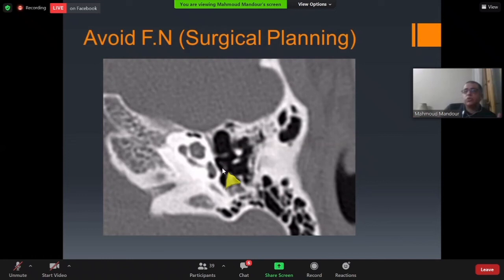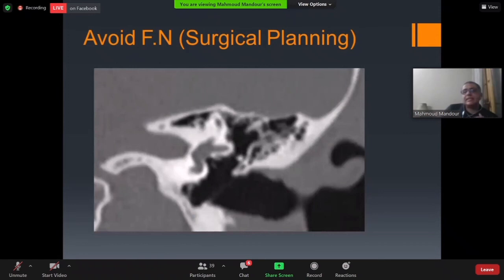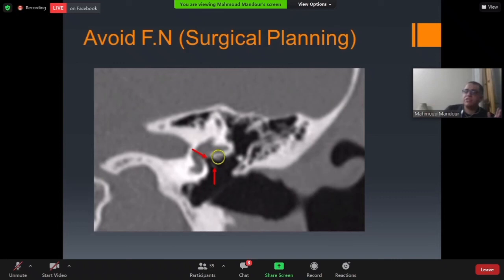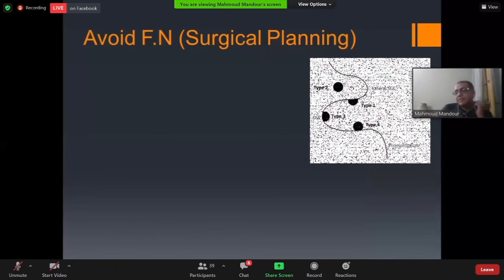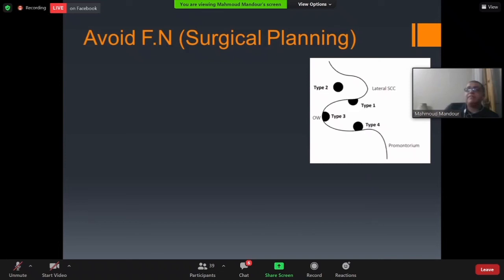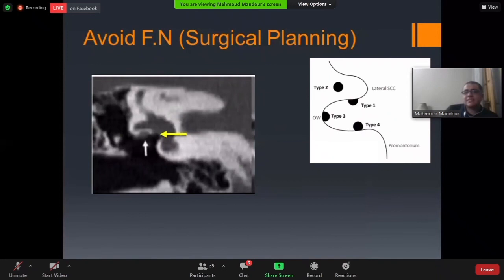Another critical point for stapedotomy is the position of the tympanic segment of the facial nerve in relation to the stapes footplate — evaluated on coronal CT. In the normal position, the tympanic segment is superior to the footplate. A classification divides this relationship into four types: Type 1 — tympanic segment just above the footplate (normal); Type 2 — facial nerve more superior, very favorable for surgery.